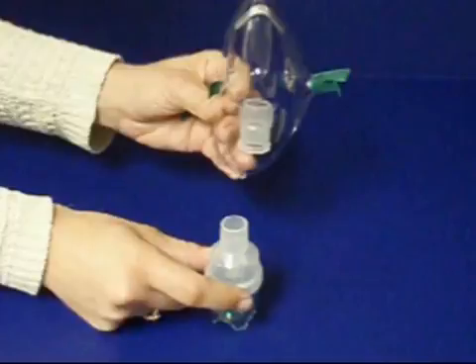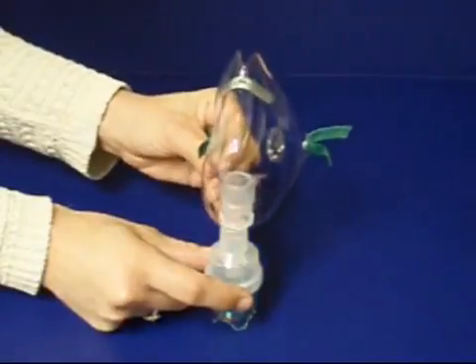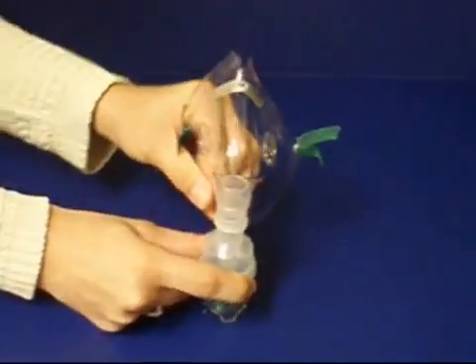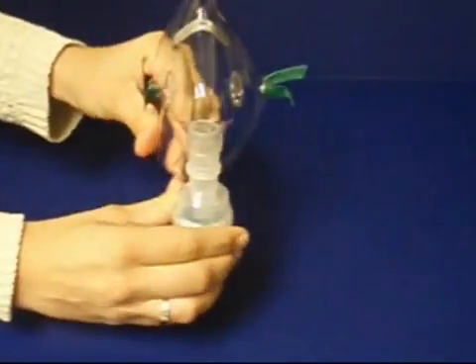If you will be using either an adult or pediatric aerosol mask for your treatment, assemble, fill your nebulizer, and connect it to the compressor as previously discussed. Then, connect the mask to the nebulizer by sliding the inlet port on the mask into the outlet on the top of the nebulizer. Your nebulizer mask assembly is now ready for use.